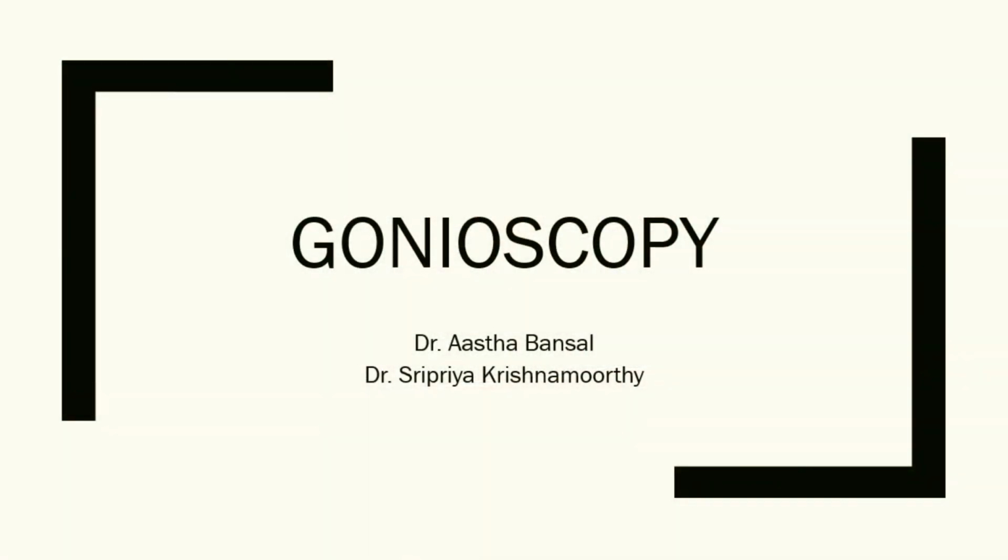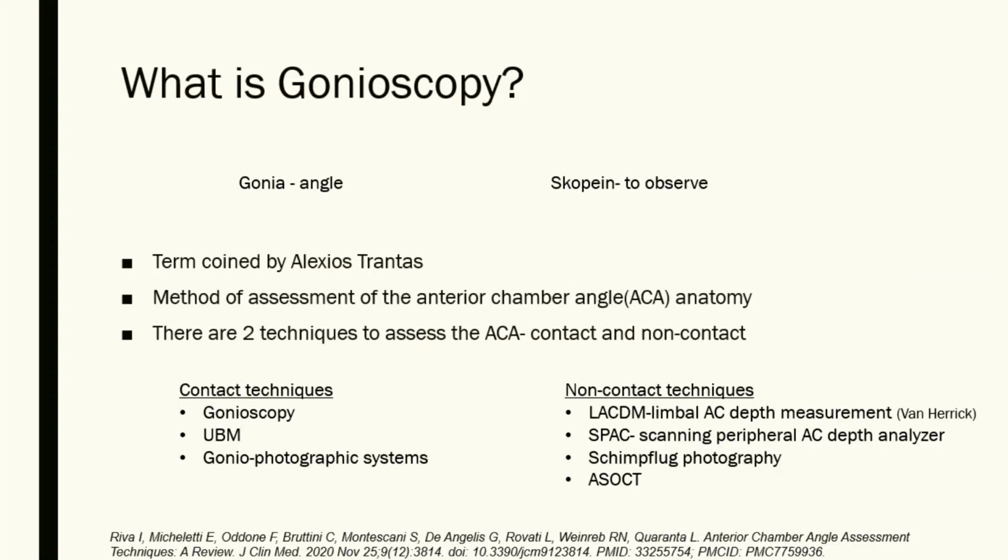Good evening. Today's topic of discussion is gonioscopy. I am Aastha, a second year PG, and today's moderator will be Dr. Sripriya ma'am. So, gonioscopy is derived from two Greek words, gonia meaning angle and scopine meaning to observe.